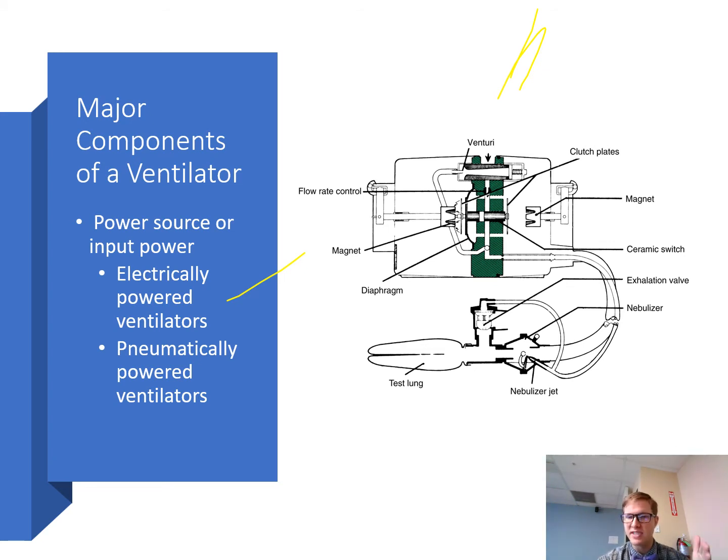So we can go back and you can see ventilators, a lot of the newer ones, will have trending on them. So we can see how the patient has done in the past 4 hours, 24 hours, and so forth. So we could actually trend data, and it will store data for some of those patients for us to help us better see which direction this patient is going. So it will allow us to also see other things like flow measurements and airway resistance and compliance. Has their compliance been improving? Has their compliance been trending down? Right? So these are very important things that these microprocessors allow us to do, so that way we can take better care of our patients.